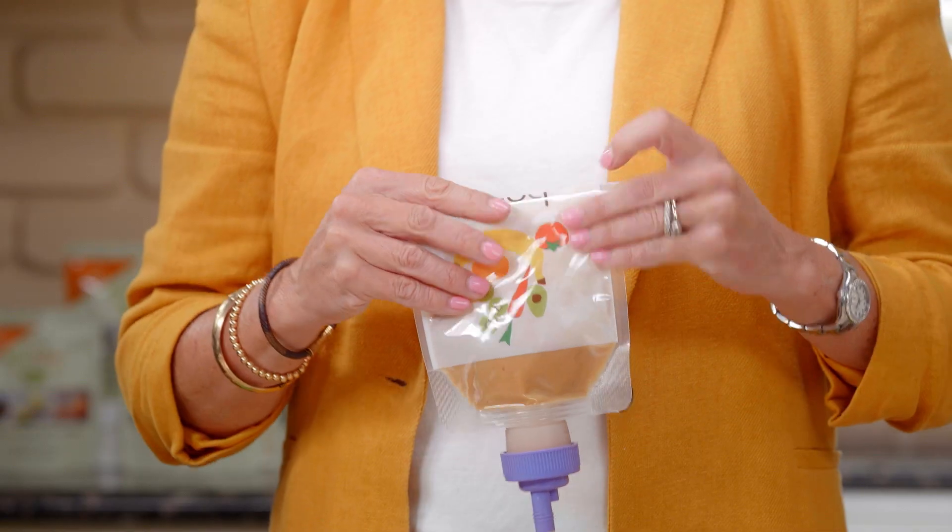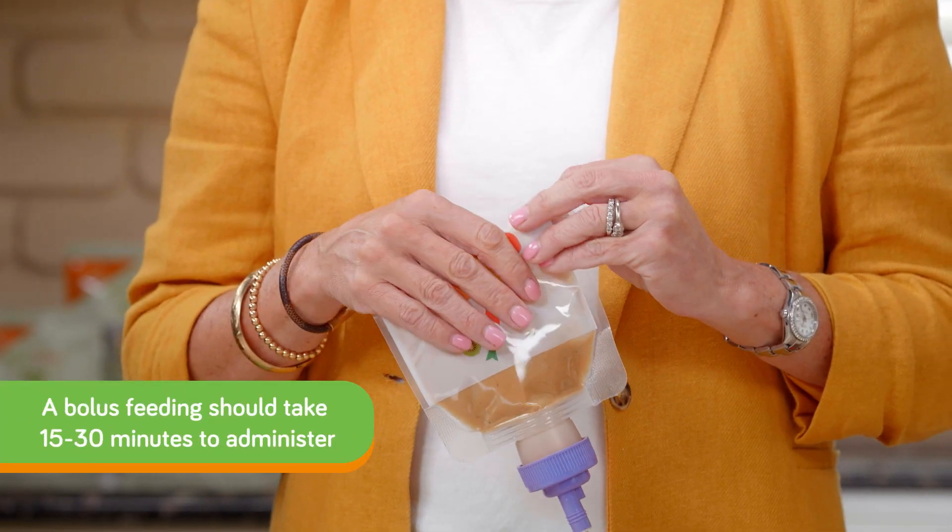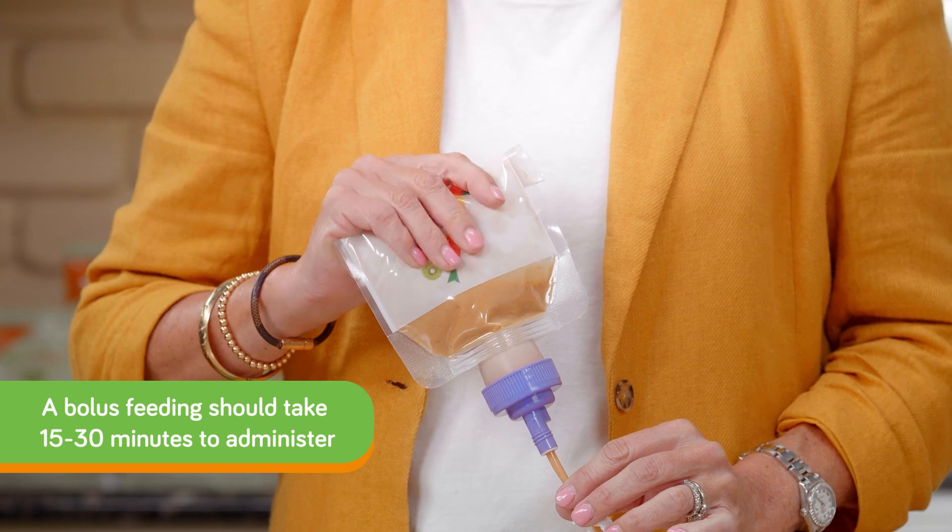With a bolus feeding via the bolus bag method, simply squeeze the bag for 15 to 30 minutes until the pouch is empty. The most recent research suggests 15 to 30 minutes to administer a bolus feeding.